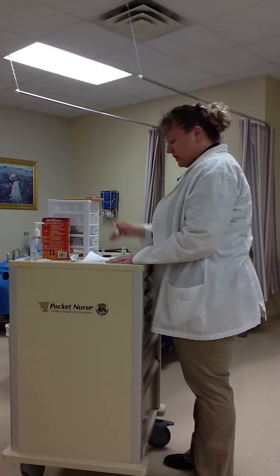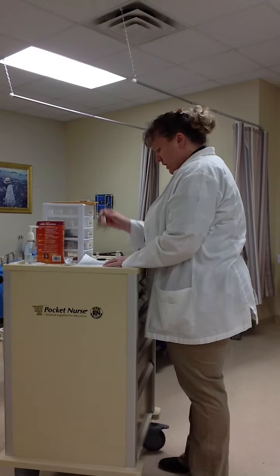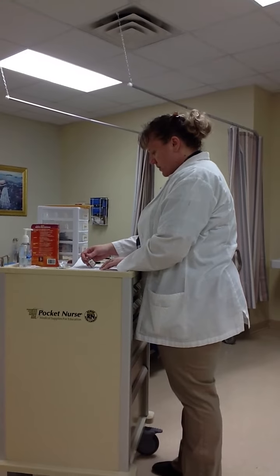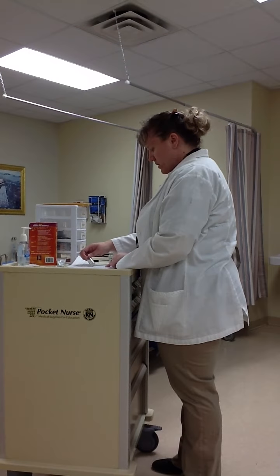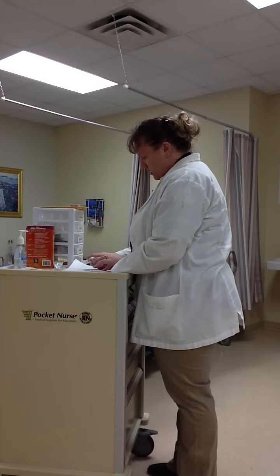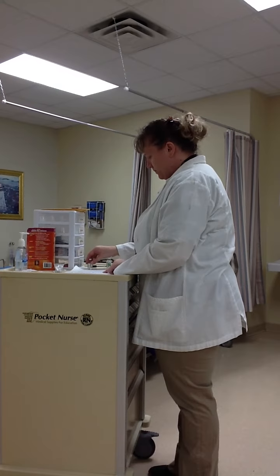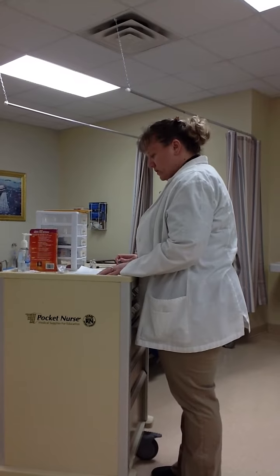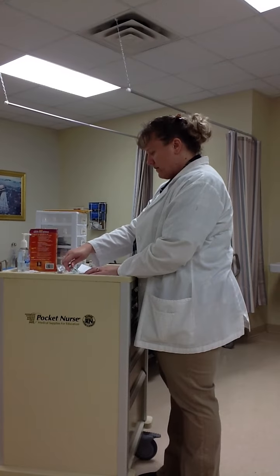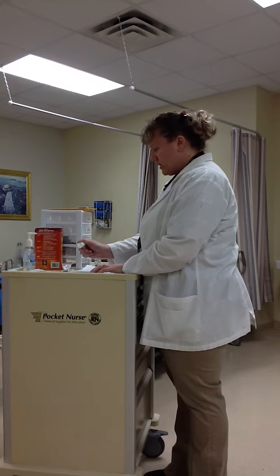I'm going to start with my regular insulin. I have regular insulin. I'm looking at it. It says regular insulin. It's a sub-Q, and it's done every AM. And I know that I'm going to get 4 units based on my 225 blood sugar. I have regular insulin that expires December of 2012, so it is still a good vial. I'm also going to check my NPH insulin, which is 24 units. I have NPH, 24 units. It's sub-Q BID, and it expires 2020.